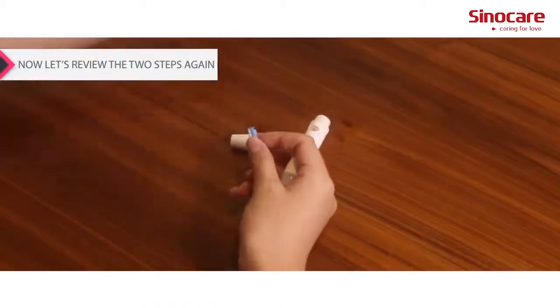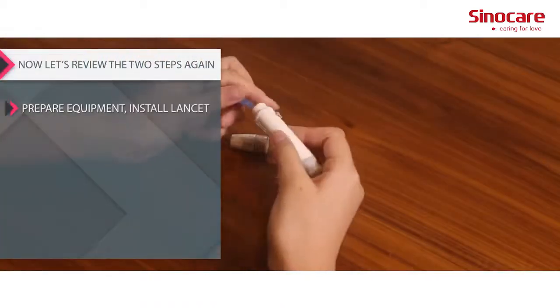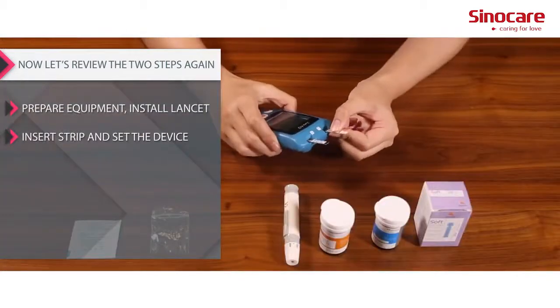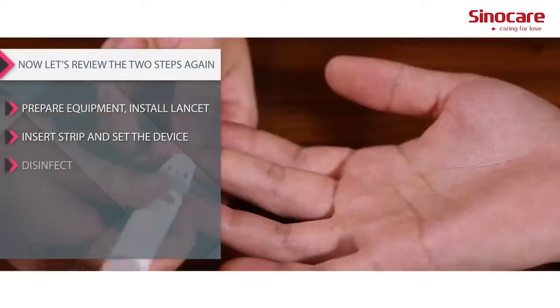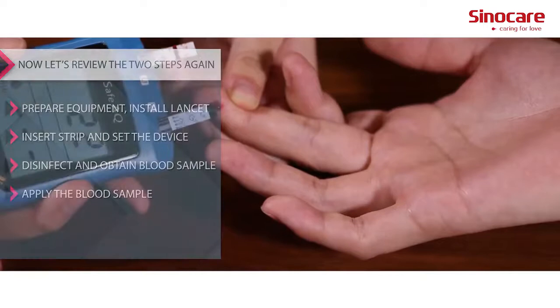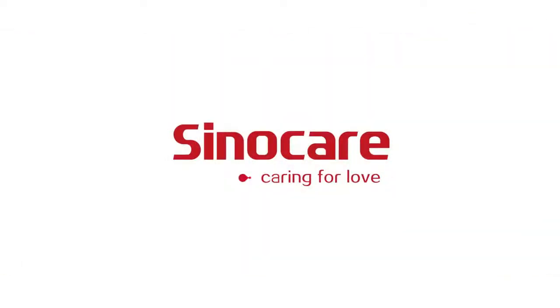Now let's review the two steps again: prepare equipment, install lancet, insert strip and set the device, disinfect and obtain the blood sample, then apply the blood sample to the test strip.